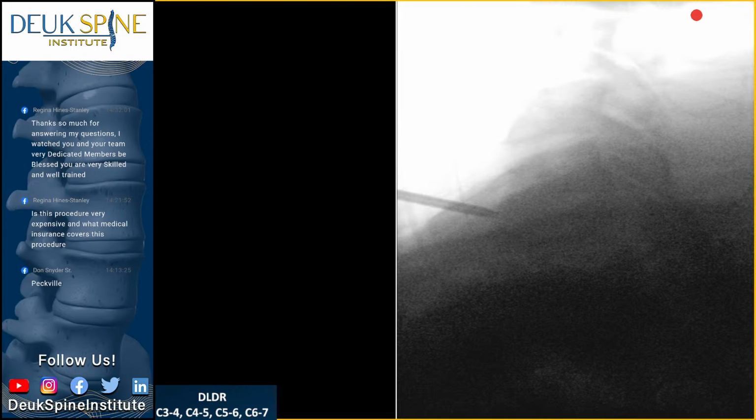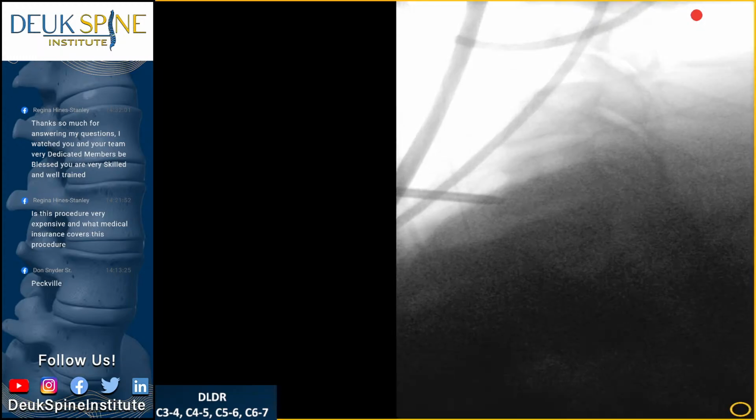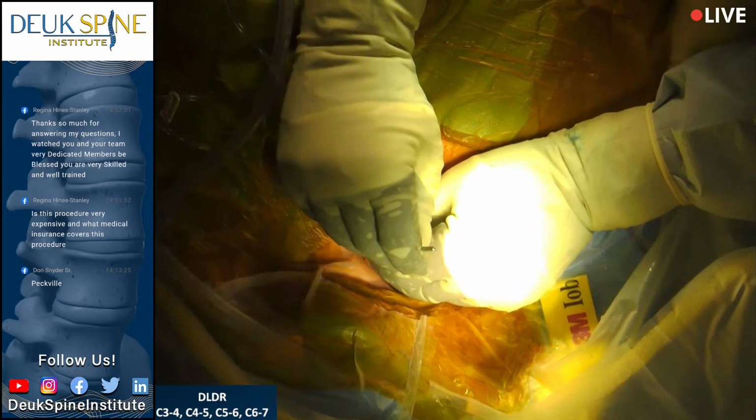Hold on, not AP yet. Let me just, yeah, hold on. All right, give me the AP. Let me move my hands. That's still middle. Lateral. Could be a little bit off to Luis's side. Just a little bit, but it's not terrible. I just need the best lateral we can do. Oh yeah, I see that I'm right on the bone, that's why.